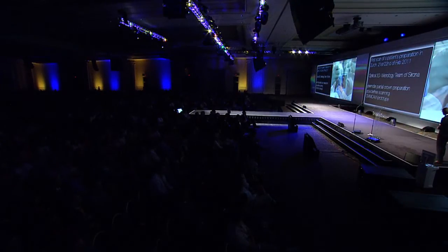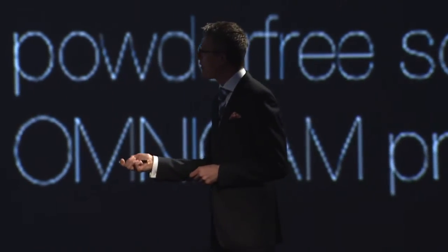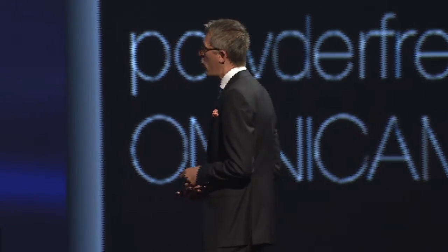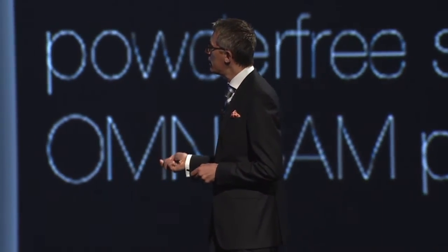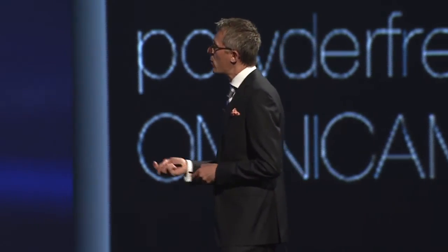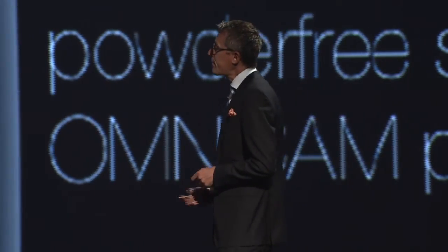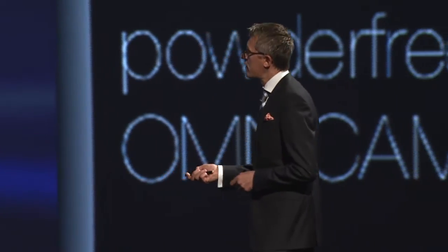I did a crown preparation with a patient. It was a partial crown preparation, and here you see this is the very first scanning without any powdering of the preparation or the adjacent teeth. Powder-free scanning with the OmniCam prototype. And as you can see here, Dr. Adamson had to look and had to work with the software because it was a very early type of the software recording this new camera.